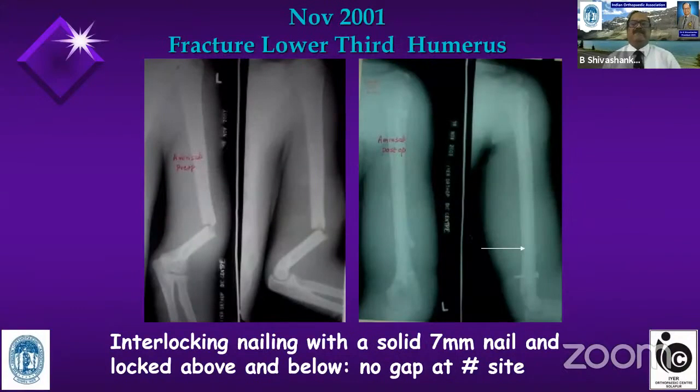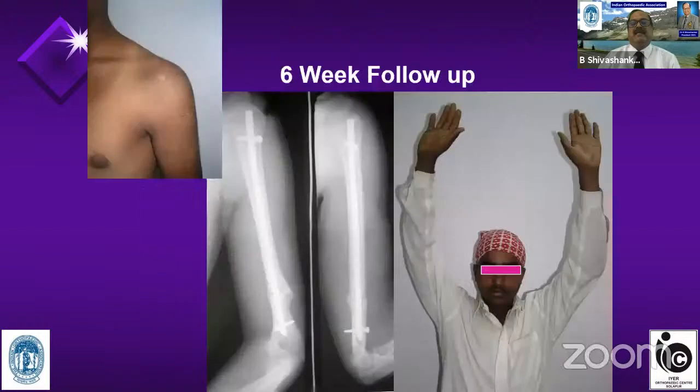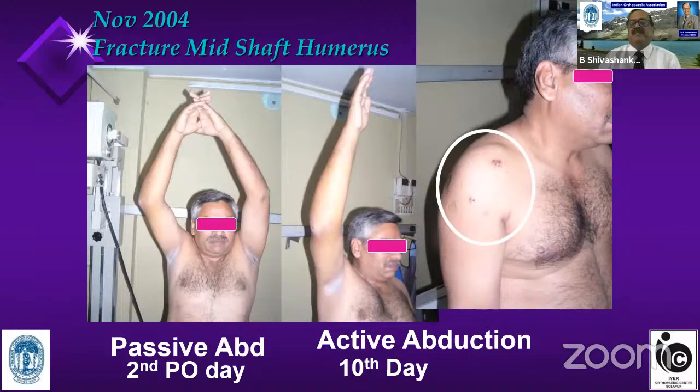Coming to my talk. Here is an example of a lower third humerus fracture in an 18-year-old adult treated with closed nailing. At 6 weeks, you can see beautiful consolidation with good function in the shoulder. I am intentionally showing the function of the shoulder because this is what is blamed most of the time by those who do plating.